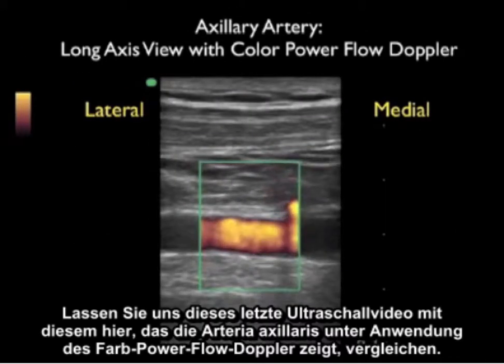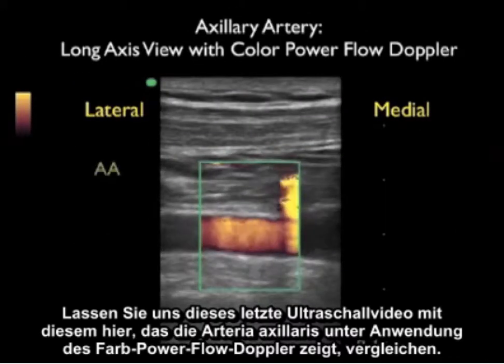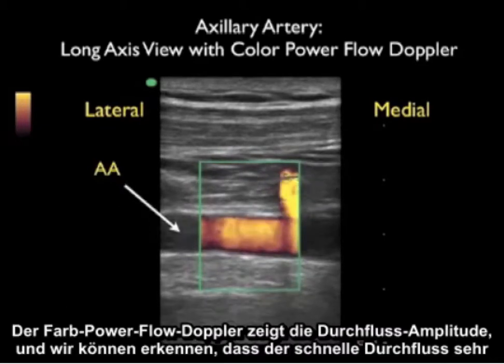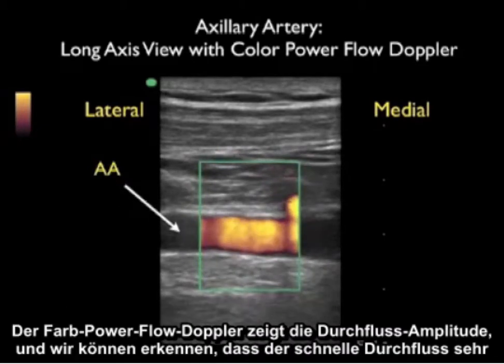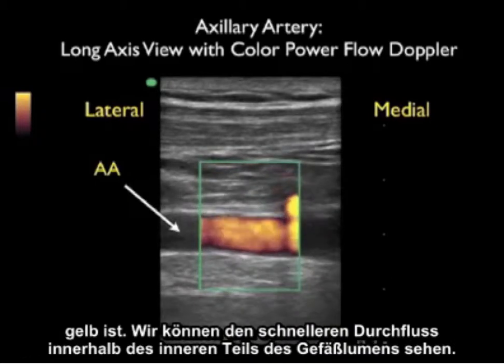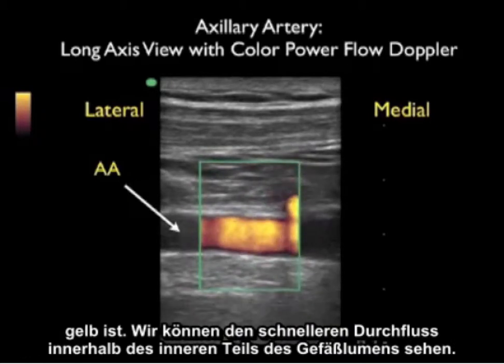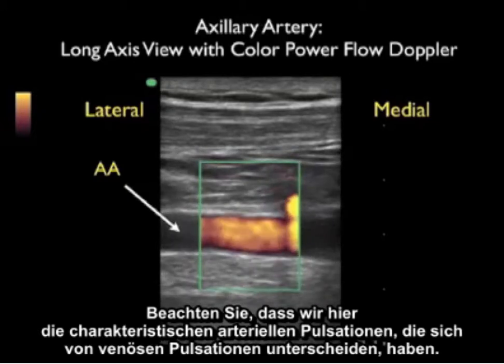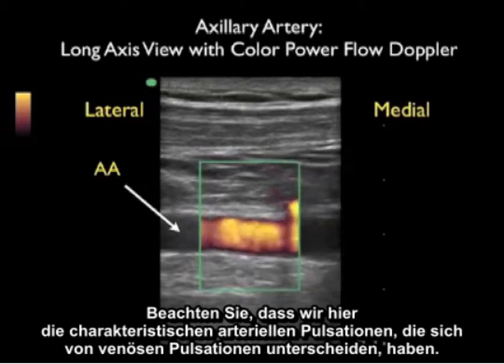Contrasting with the axillary vein, here is the axillary artery using Color Power Flow Doppler. Color Power Flow Doppler shows amplitude of flow — faster flow appears very yellow and is visible within the inner part of the vessel lumen. The characteristic arterial pulsations clearly differentiate this from venous flow.